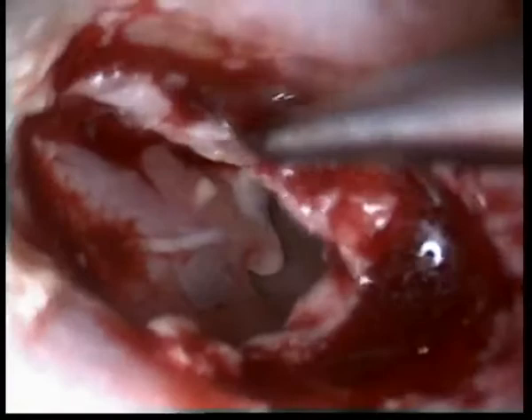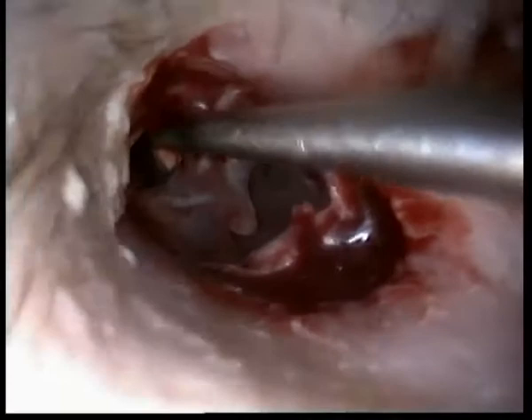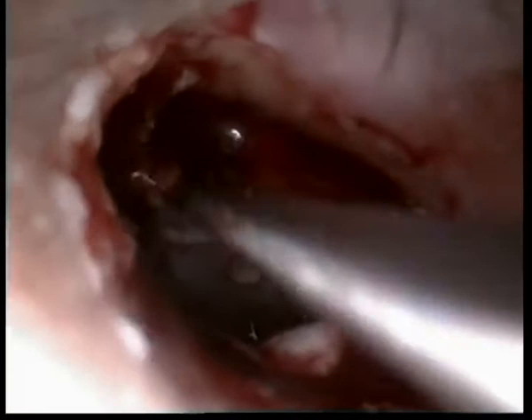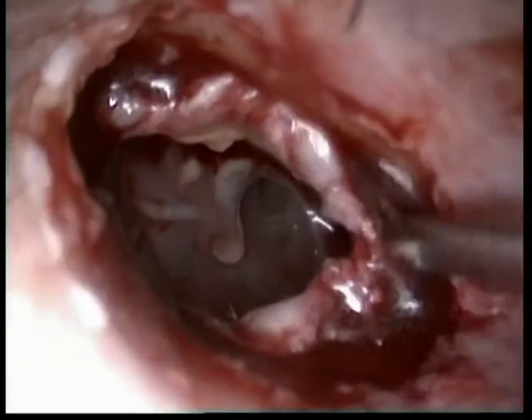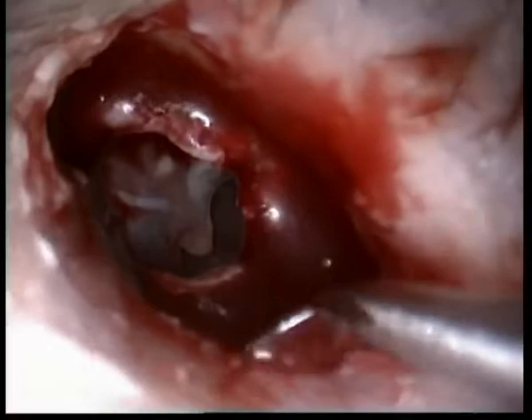And do as much as you can. The most important, the difficult area is superiorly to make the cut, but anyway. So elevating the skin, making it fold, and then put the pledget in if I can. Sometimes you have to put the pledget earlier, but elevating as much as I can. Give me a pledget, please.